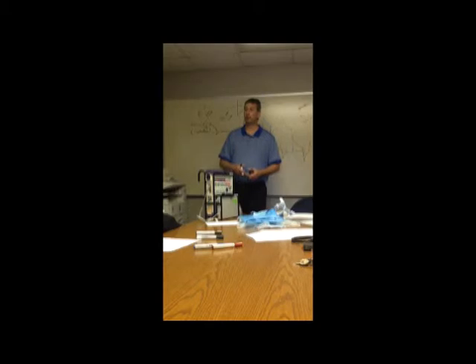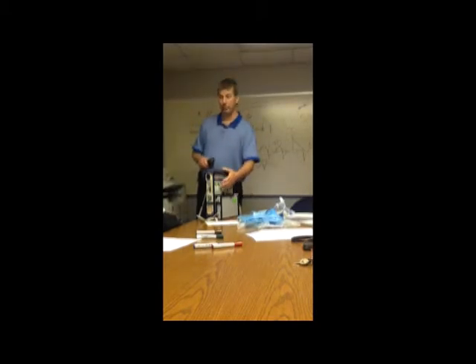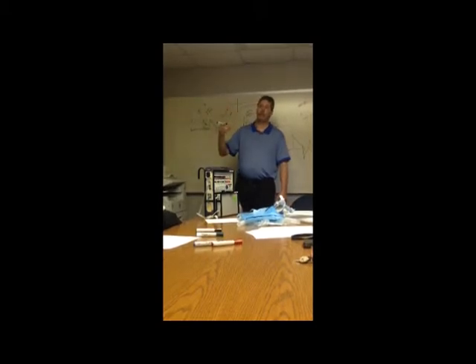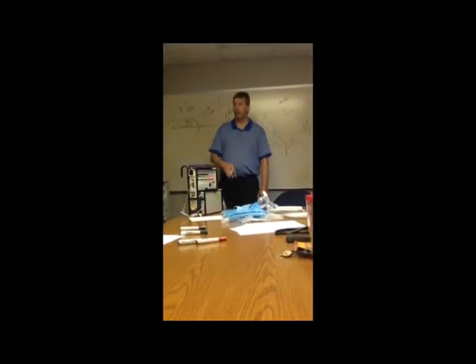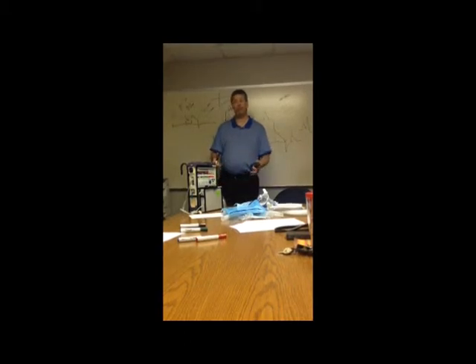If they've got digital clubbing, or if they use oxygen at home, or any of that, 88, I wouldn't do much more than 88. And what I mean by that is, I'd get them up to 90 or 92 if the only thing I'm changing is their oxygen percent. If I get to 100 and they're 88, I don't think I'm going to start increasing their EPAP to improve their oxygen anymore in that patient unless it's clinically indicated by how they looked, meaning he's still working hard.